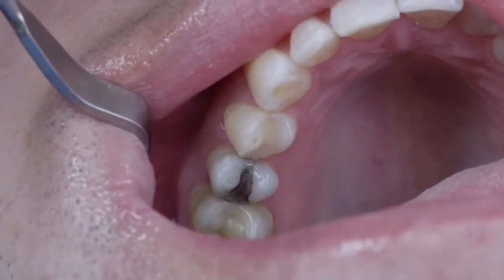A patient visited my dental office for a routine checkup. During X-ray diagnosis, I discovered a cavity in tooth 1-4 that required treatment.